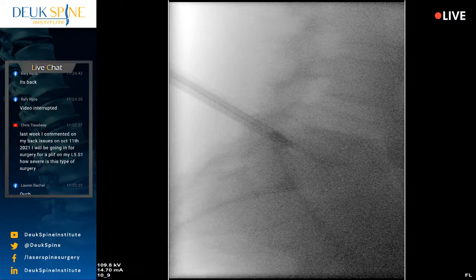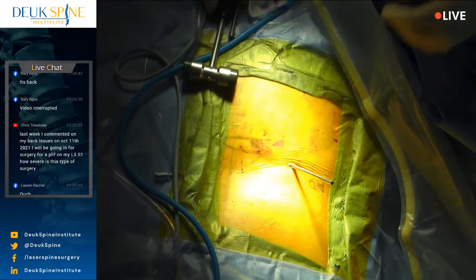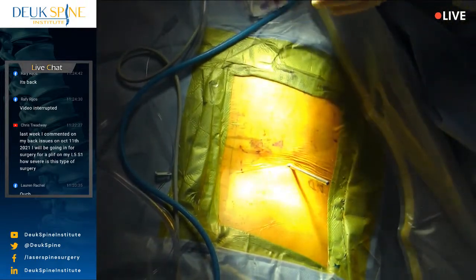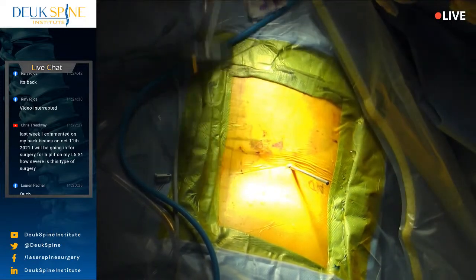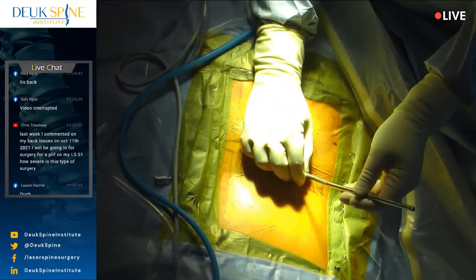All right, now I've done what I can do using my fingers. I'm going to advance this dilator through the tear, pushing the herniation in along the guide wire. All right, and there you are, we're inside. Now it's really easy to get in because the tear is pretty big. So I'm going to advance it a little bit more just so I'm really where I want to be, just embedded. You don't want to go past 2/3 of the distance across the vertebral body front to back.